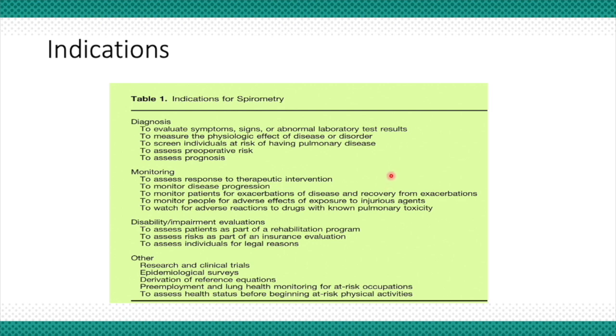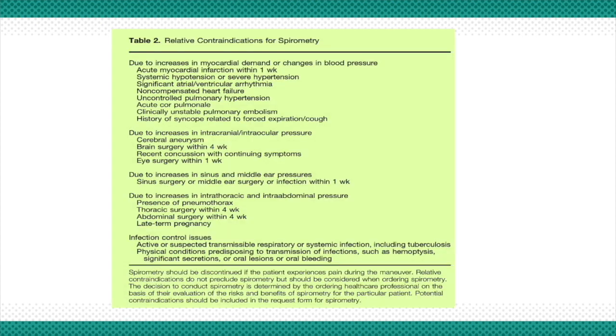We use them for monitoring, and this is even more important because the guidelines mention that repetitive assessments have more value, more worth in patient survival and patient's prognosis than one single value. We use it to assess disability, we use it pre-operatively and for a number of research purposes wherein drugs and their effects on the lungs are assessed.